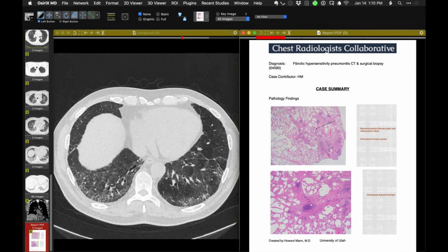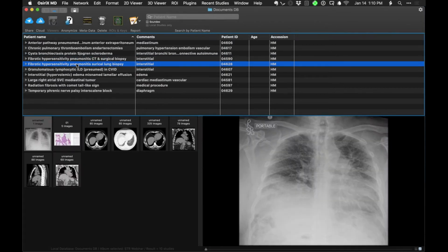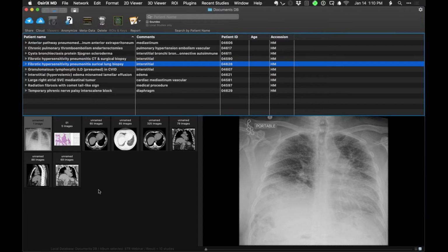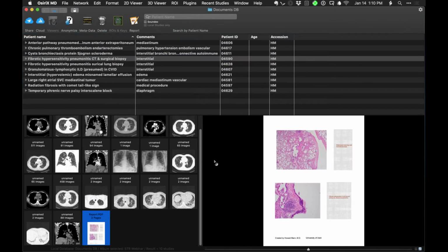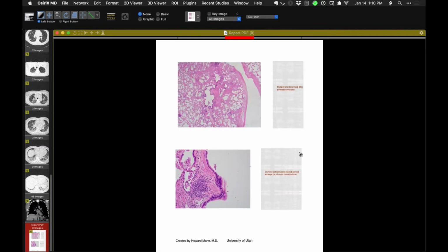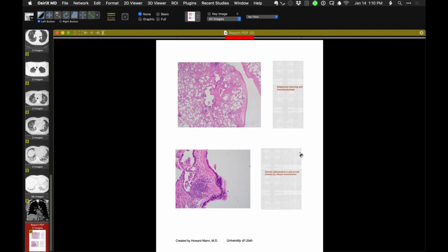And I'll show you. Were there any poorly formed granulomas, and was there an antigen? Nope, neither. Because we've certainly seen patients that have UIP plus, or they have fibroblastic foci. Were there any in this case? Because you'll occasionally see UIP with additional bronchiolocentric fibrosis, and those are the ones that are tough and often, in our classifications, still end up being classified ultimately as UIP.